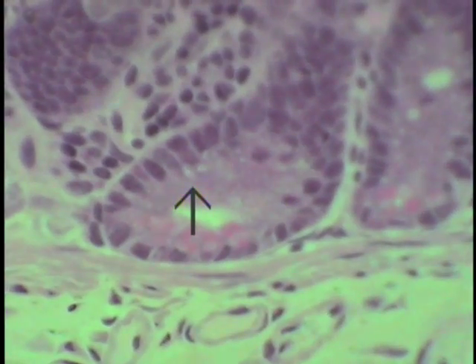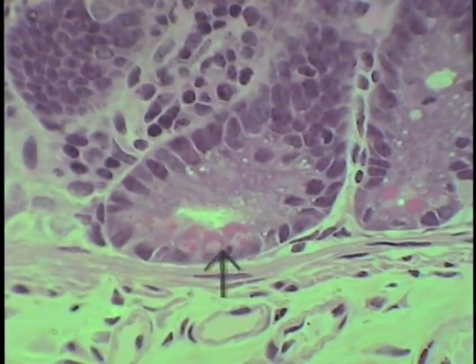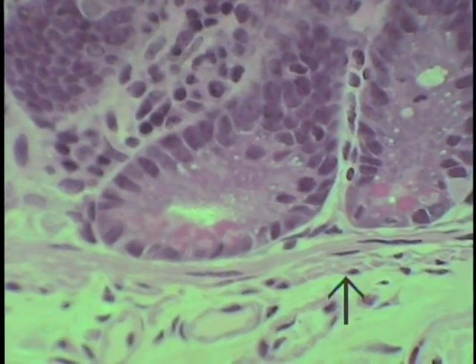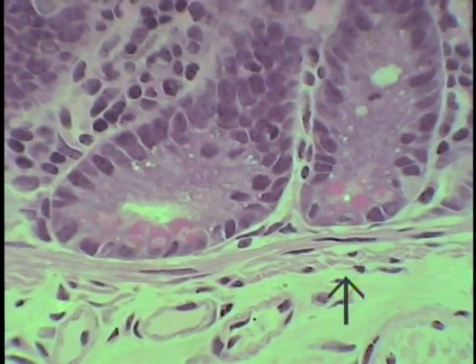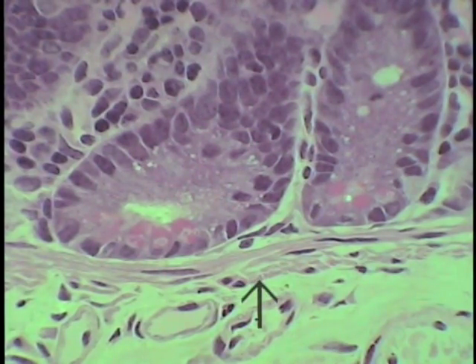And again, almost each one of the intestinal glands at their base, one should find these Paneth cells, scattered enteroendocrine cells, and then if one goes up the villus wall or the wall of the crypt, more goblet cells and more different types of enteroendocrine cell. Here one can see the muscularis mucosae in this jejunal section, seeing that it's made up of actually two layers mimicking the muscularis externa, an inner circular layer and an outer longitudinal layer. And the muscularis mucosae throughout the gastrointestinal tract will mimic the layering as seen in the muscularis externa.